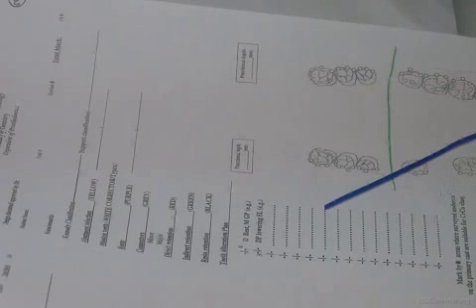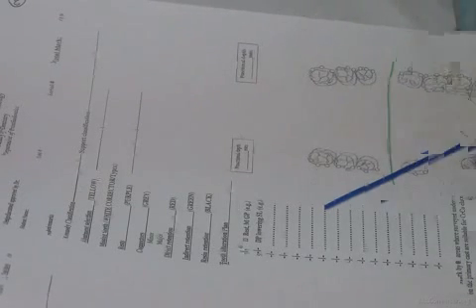The case after it, 2 pages after. Here I need to add for indirect retention. Although my components are all complete in this case, if this is my fulcrum line, I have all components here, and I can place some of the components. I'm going to eliminate some of them on the central. But the idea is, I can place my components, but here I'm adding for indirect retention and for cross-arch stabilization together. I need to extend my design posteriorly. Okay?